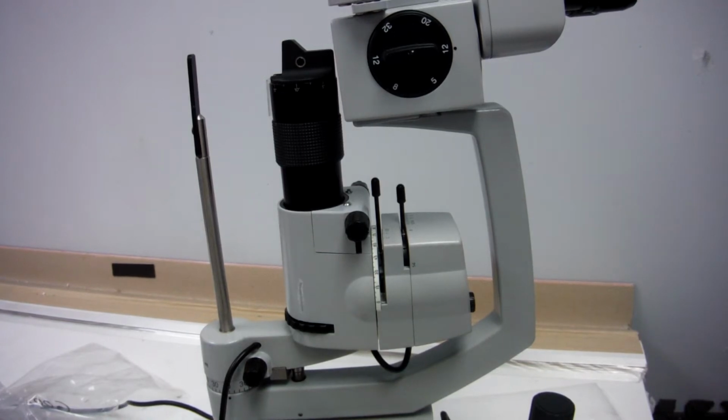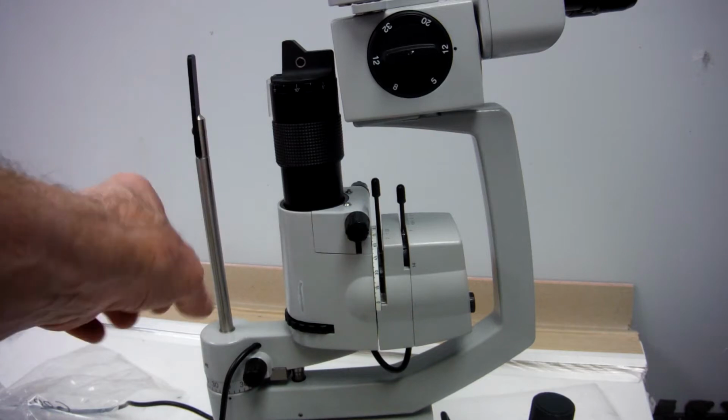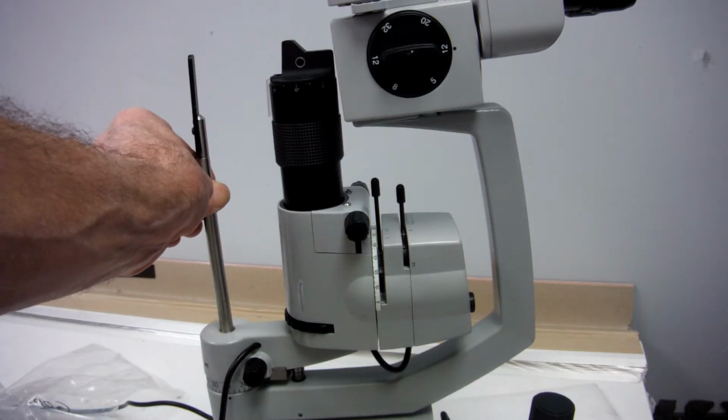On the Zeiss SL-120, there are some quick checks that you can make, some simple adjustments to align your target up on your focusing rod.